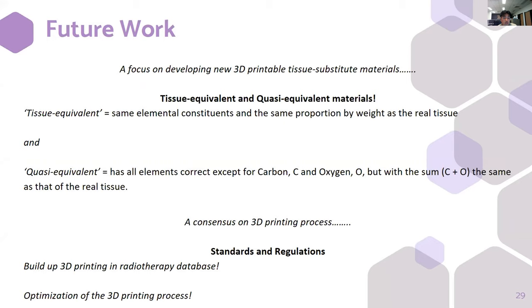Research should also focus on forming consensus on the 3D printing process for fabricating reliable and clinically functional phantoms for radiotherapy applications. Here I highlight the importance of documenting all your 3D printing parameters and processes which are utilized to fabricate these radiotherapy devices. And I encourage more studies to build up the 3D printing database and explore other exciting applications in radiotherapy involving proton therapy QA, deformable image registration, adaptive dosimetry, nuclear medicine, and radiomics.